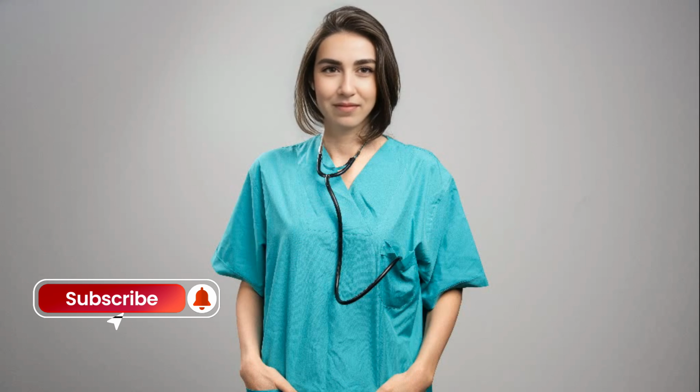Common risks of angioplasty. 1. Bleeding or hematoma at the catheter insertion site. Bleeding at the puncture site, usually the wrist or groin, is one of the most common complications. Sometimes, a small collection of blood, hematoma, may form under the skin. Typically, this is mild and resolves on its own, but in rare cases, severe bleeding might require further treatment.